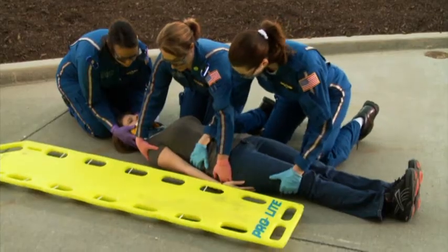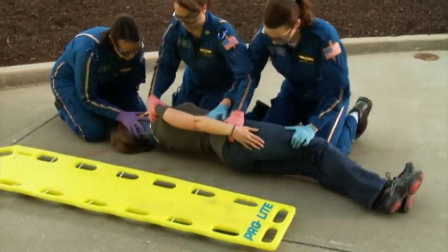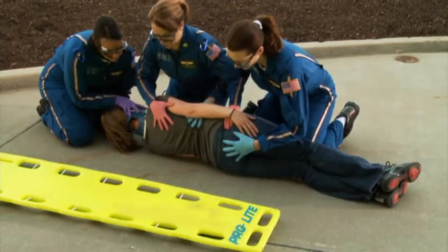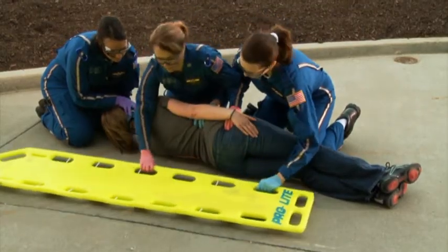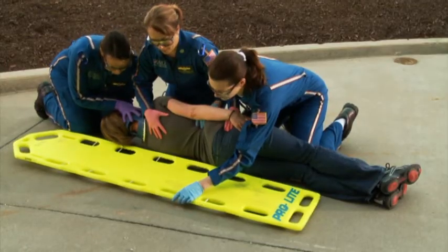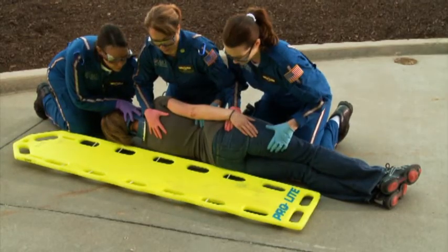On command from the first provider, the patient's entire body is log rolled as a unit slightly onto the patient's side, while neutral spinal alignment is ensured. The longboard is moved into place behind the patient by the second and third providers, while holding the patient on the side, with the foot end of the board positioned between the patient's knees and ankles, and the head of the longboard extended beyond the patient's head.